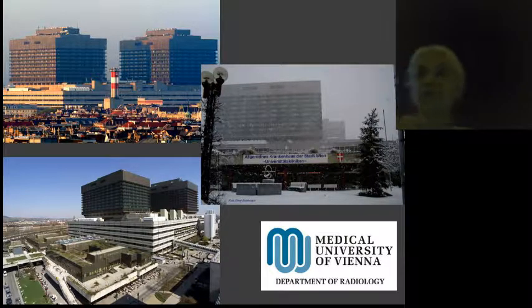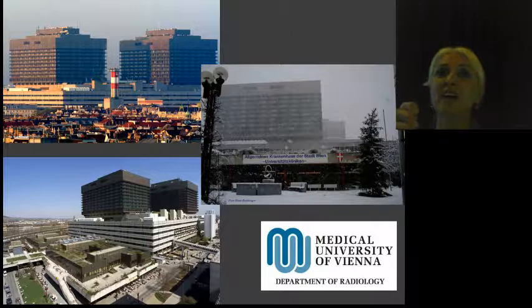Okay, first question, how can we distinguish lymphoma from toxo? We still can't really do it very well. Is that the answer that you were expecting, or did you expect a new sequence? We still go with the whole brain tumor imaging protocol, and then they go for PET, if we can have PET immediately, and still give a therapy, and after 10 days repeat. So none of the sequences is 100%. Some people like nuclear medical techniques. I don't so much. I don't have an impression that I can do this.